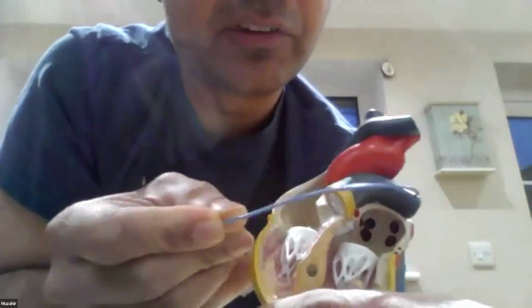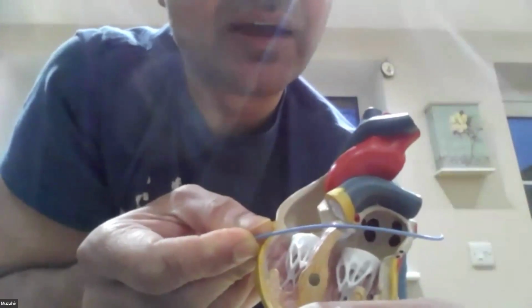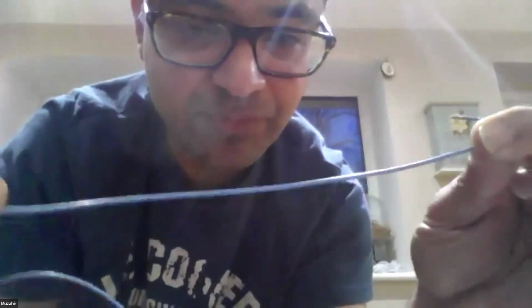I don't know whether you can appreciate that. It's a little bit difficult to demonstrate, but that's LAO, and that's in RAO. In RAO, the catheter is more vertical. In LAO, it splits out and helps separate the coronary sinus. Both of them are useful to determine how lateral you go and how apical you go as well. Those are the little bits I wanted to add from an EP perspective.